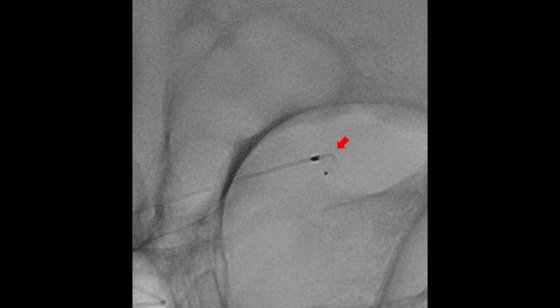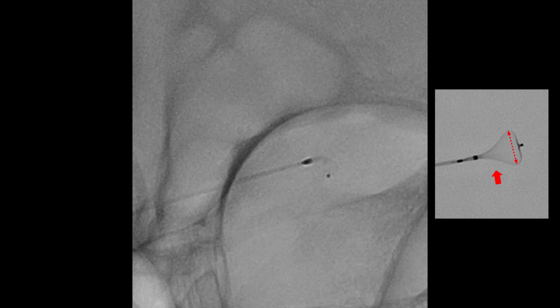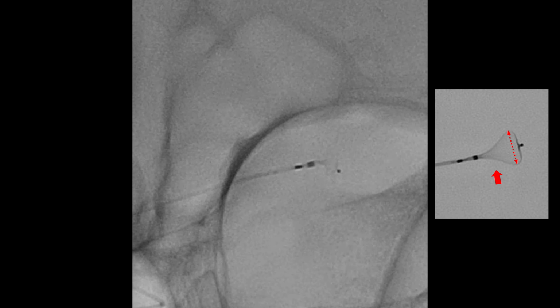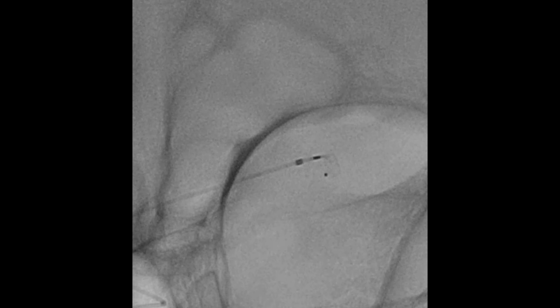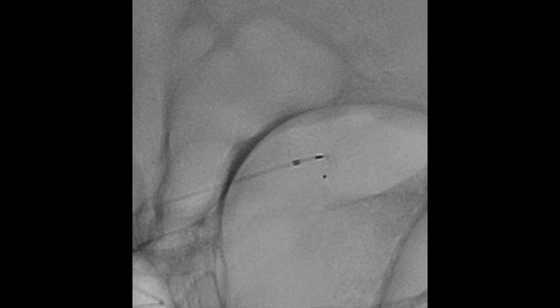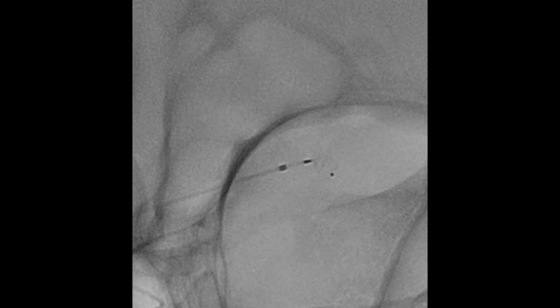Watch out for this common pitfall. When the distal end fully expands but the operator keeps pushing the device against the aneurysm wall, we often see this folding issue occur. When you see incomplete expansion like this, gently rotate and derotate the device. Watch how this back and forth motion helps coax the implant into full expansion, just like we're demonstrating here.